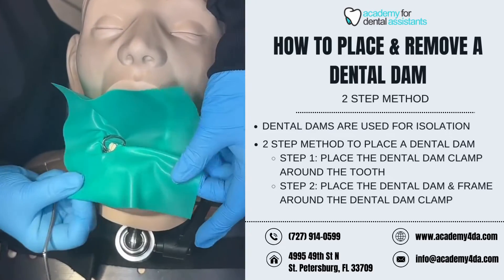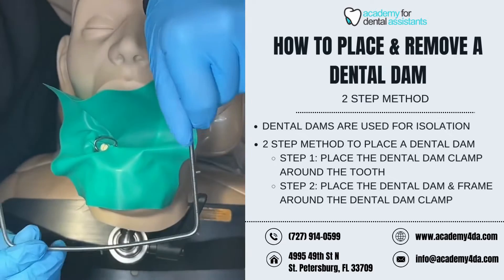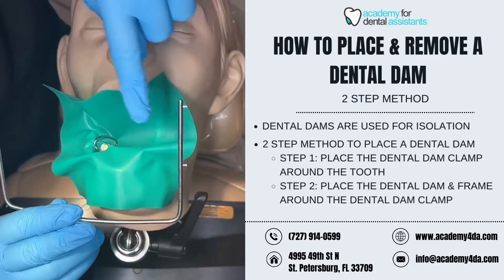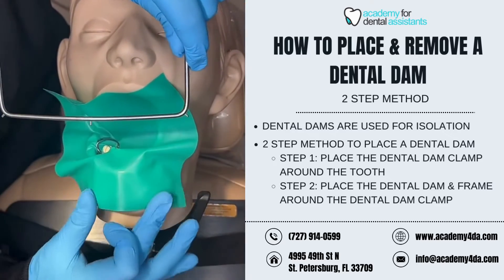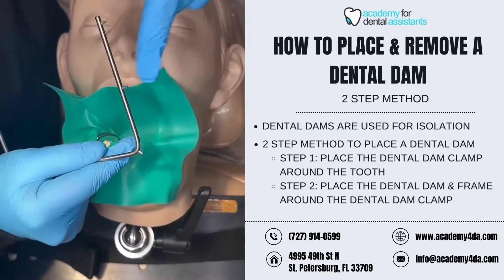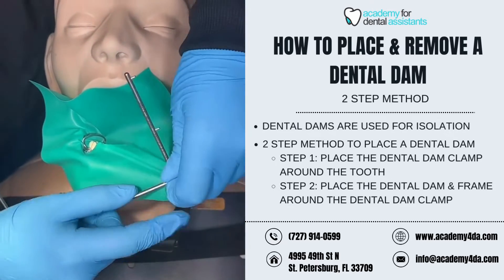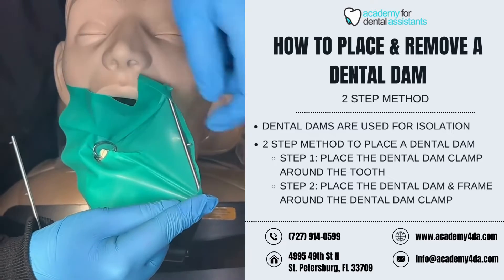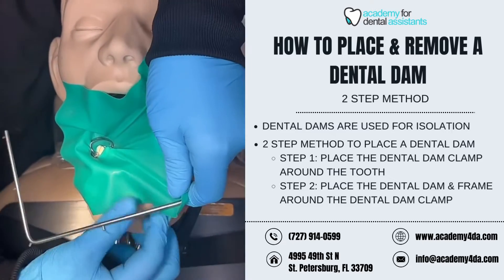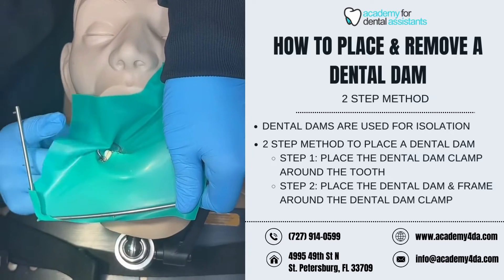Now that I've wrapped my dental dam around the dental dam clamp, I'm going to use my frame. The open end of the frame goes up towards the top of the head; the closed end goes down towards the chin. The projections or prongs on the dental dam frame are what I'm going to stretch and wrap the dental dam around to pull it taut, so it's nice and tight to help form a good isolation for the dentist and the dental assistant.